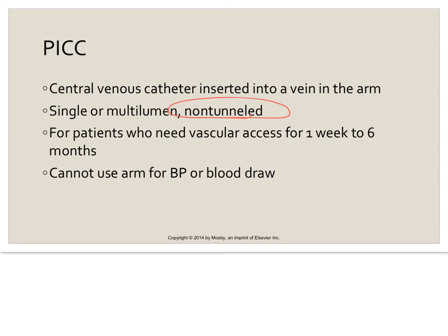It's very useful for someone who has prolonged needs, and it can stay in, if properly taken care of, up to 6 months. Just remember the side that this is on. You cannot use that arm for blood pressure or blood draws. These patients a lot of times can have this placed at the bedside by a nurse who's been properly trained, or sometimes they will go down to interventional radiology to have a PICC line placed.